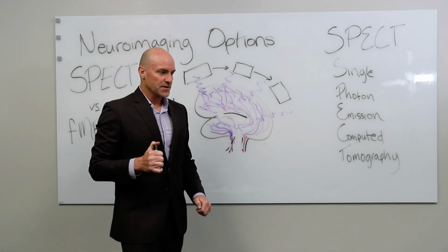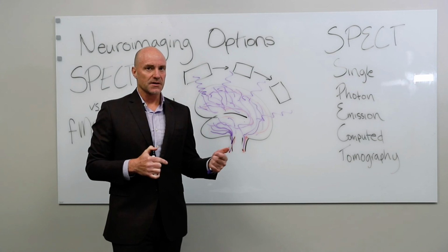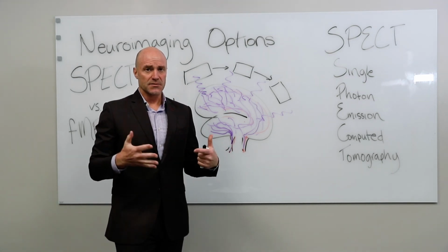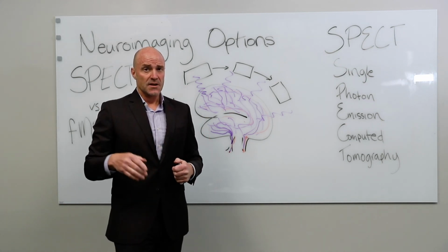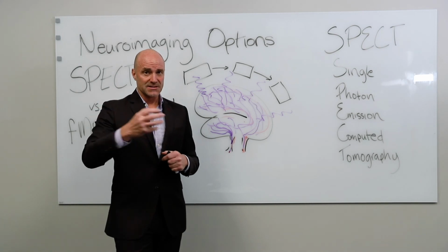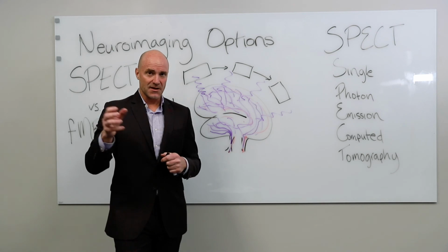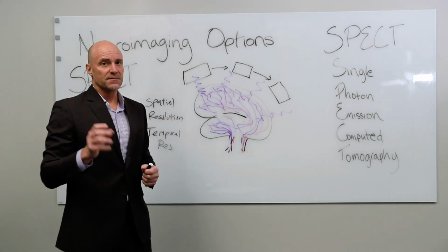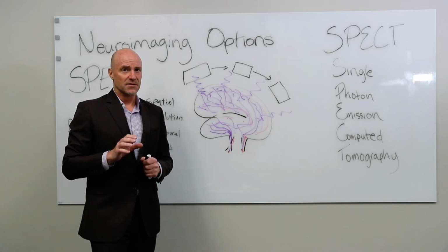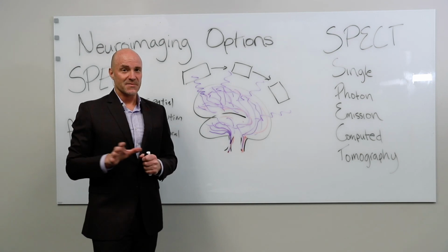Cognitive tasks, when you're actually engaged in thinking, you're doing a lot of things fairly quickly. So even something like a memory task, you're given some words to memorize, second by second, your brain will be engaging different regions at different time courses, but they're all relatively fast. In other words, these are things going on at a second by second level, if not sub-second, not necessarily at a minute by minute level.